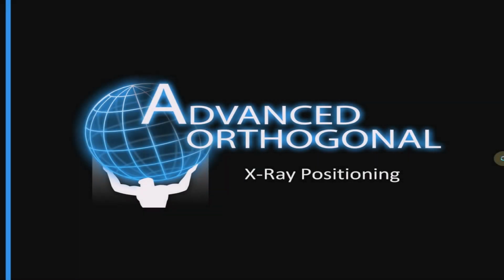In the same way that a skyscraper over the New York City skyline was built on exact blueprints, a precision Advanced Orthogonal spinal correction can only be obtained from accurate analysis from properly positioned X-rays. So welcome to the Advanced Orthogonal X-ray Positioning course.